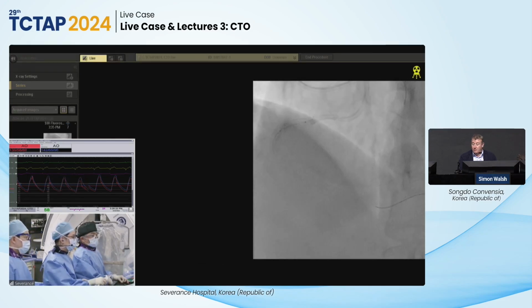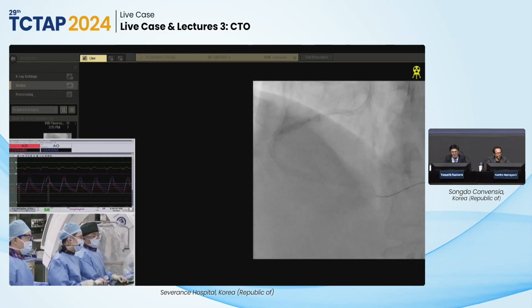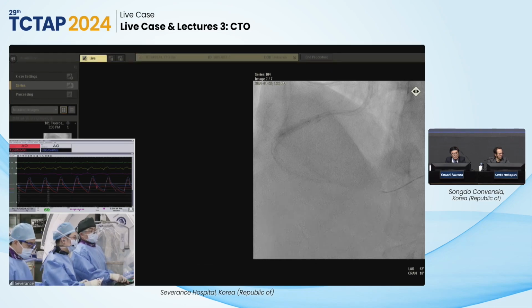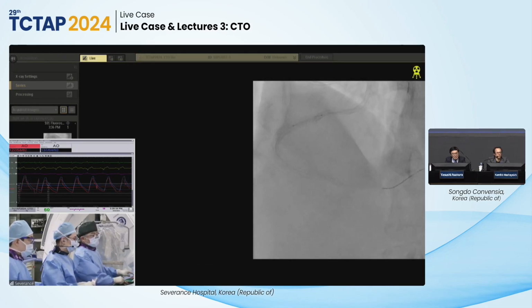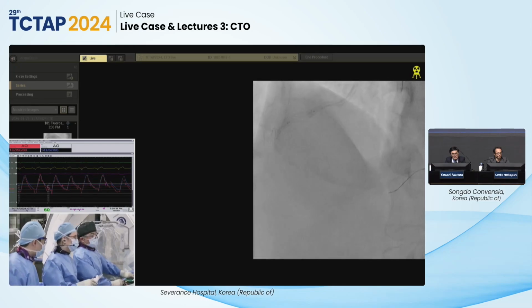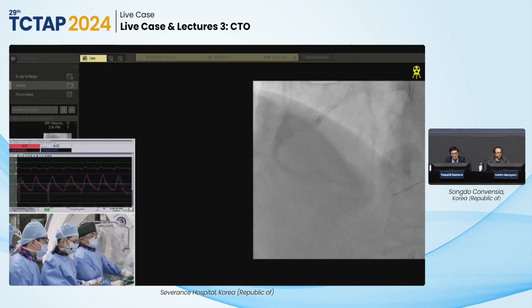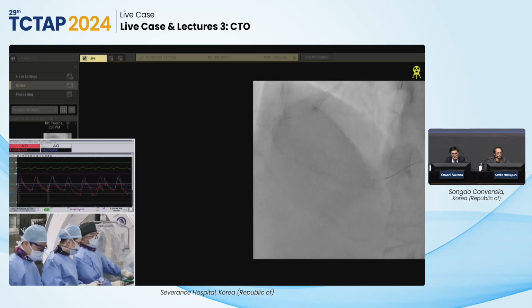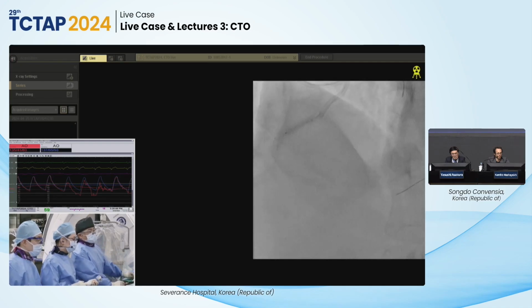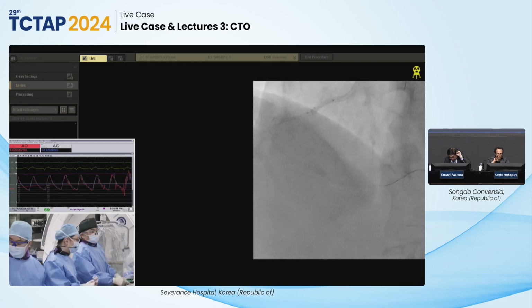Yeah, we still have 3 minutes to go, and probably we can give some nitrates and then check how the distality looks. Okay. 18, 24, 26, 26. Okay, nitro.